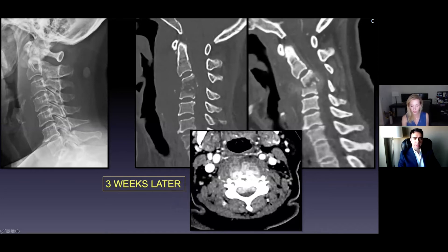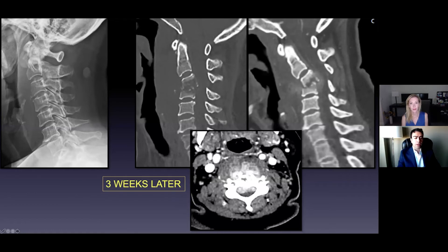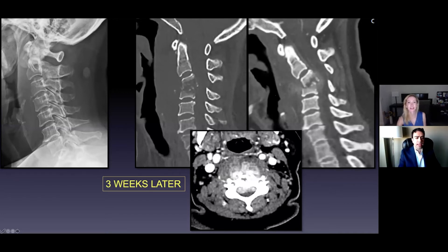Let me talk about how I look at this for surgical planning and clinical assessment. This patient has very significant prevertebral soft tissue swelling. Very rarely, this can compromise the airway, so the first thing I look at is the trachea. In this case the trachea looks patent, so this patient is not having any breathing difficulty and the airway is secure. The next thing is looking at the patient's alignment.